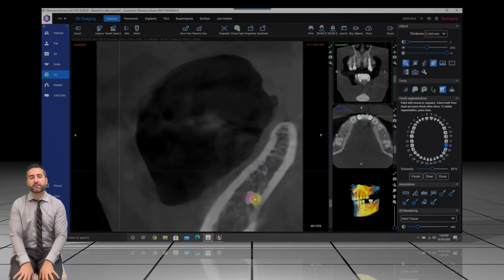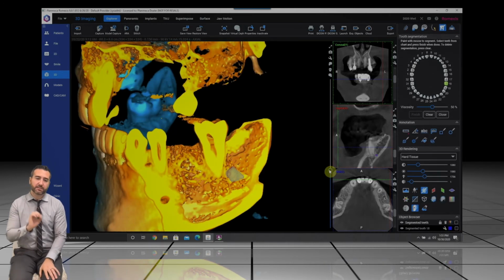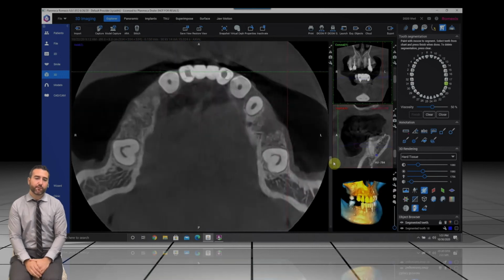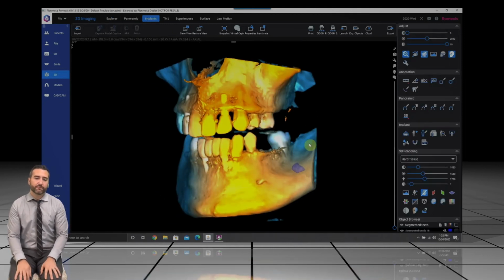Here the patient has a radiopaque lesion that I'm highlighting in 3D for them, and then I'm going to be able to show them that. I could hit a button and instantly send this off for a path report to a service to be able to read that for me if I was uncomfortable with developing a differential diagnosis there. So you could partner with various services.